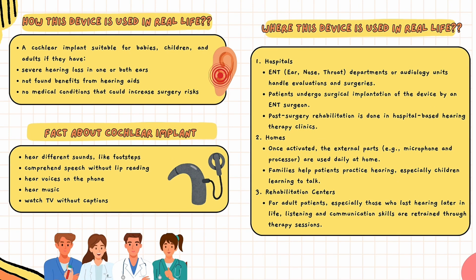Facts you have to know about cochlear implant. You can hear different sounds like footsteps. You also can comprehend speech without lip reading. You can hear voices on the phone, hear music, and watch TV without captions anymore.